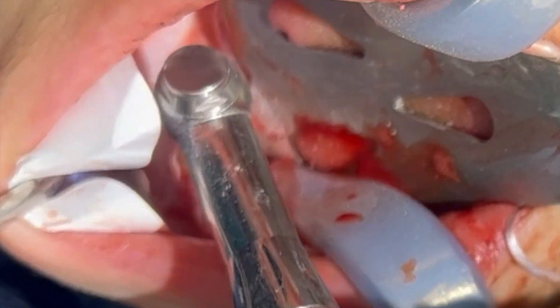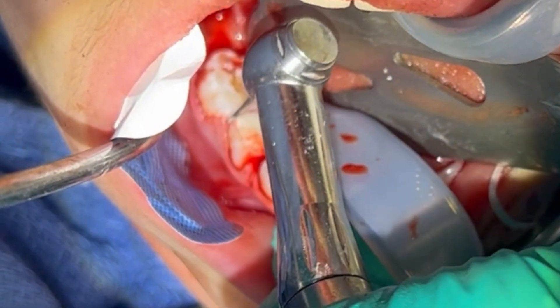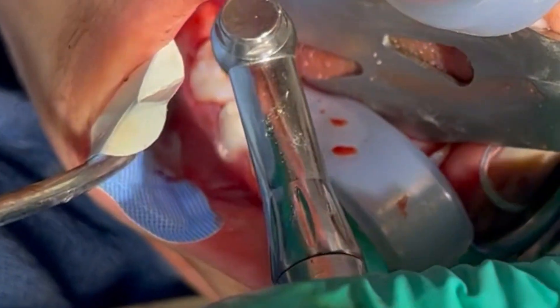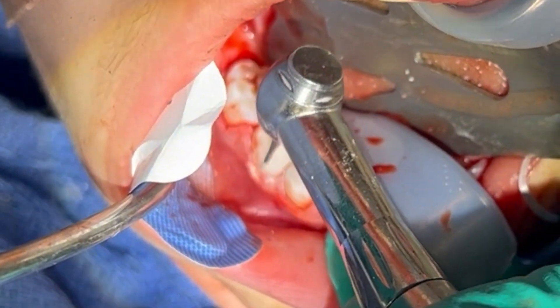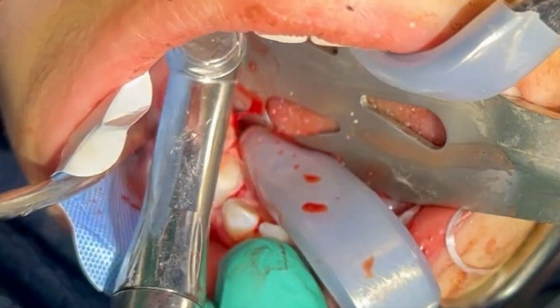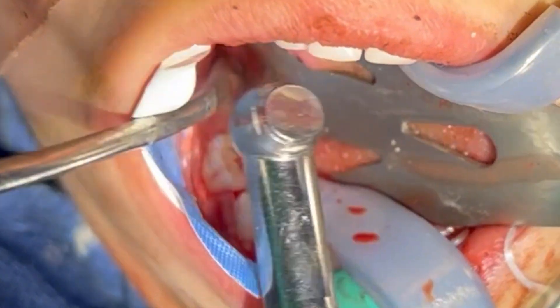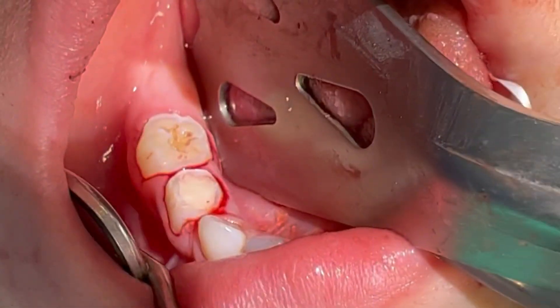This is different from your standard stainless steel crown prep. Additional interproximal reduction includes circumferential reduction with minor reduction of the buccal bulge and lingual walls. Proximal line angles are also rounded and smooth. This will allow for the snug and active fit that the BioFlex crown requires. This preparation is significantly less aggressive than a prefabricated zirconia preparation, but also slightly more than a pediatric preformed stainless steel crown.